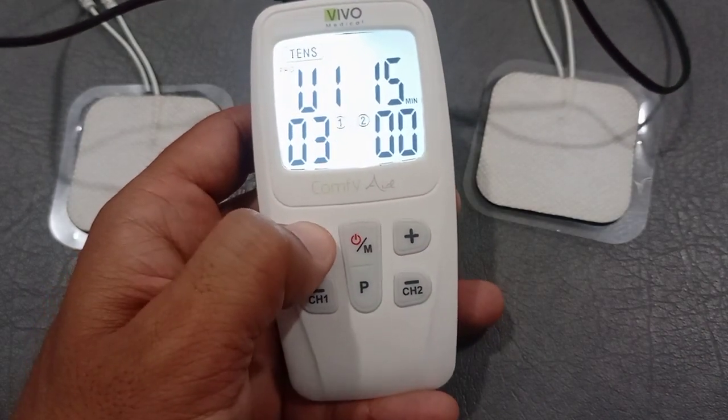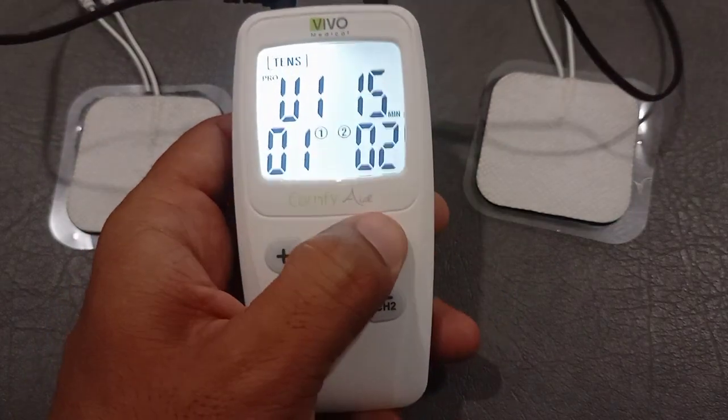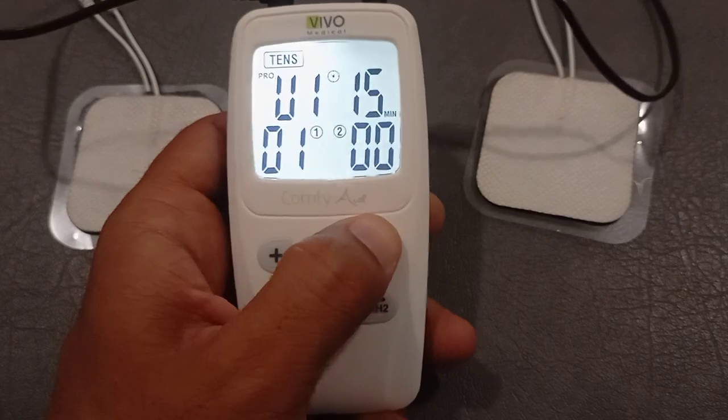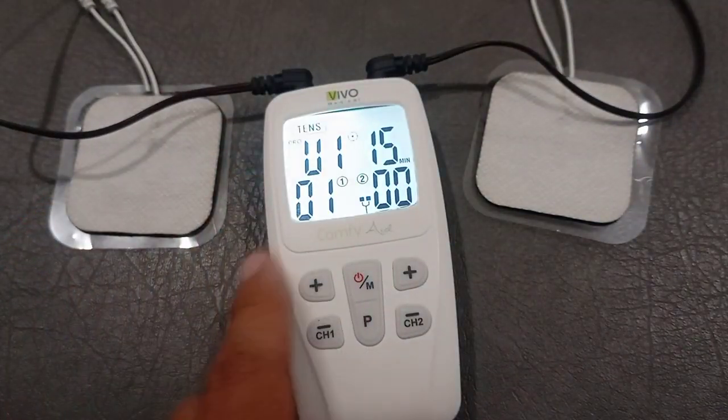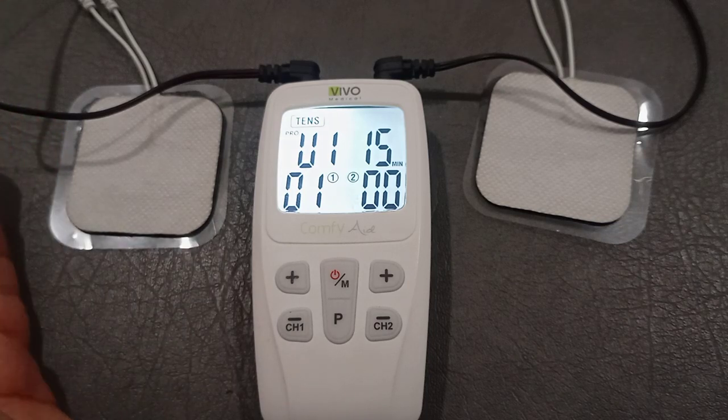And if we increase the intensity, you will see that it will not go beyond 4 or 5. The reason is that there is no contact between the electrodes, and this is a safety feature. One by one we are going to discuss the different electrode positions for different clinical conditions or for different regions of the body.